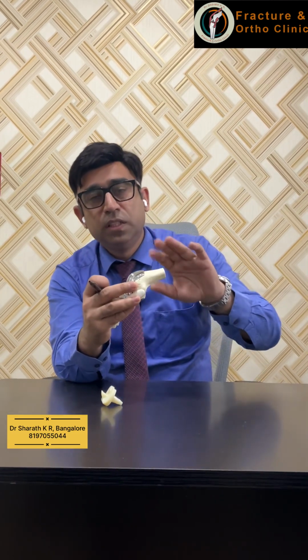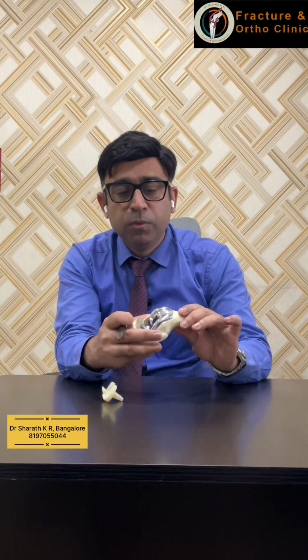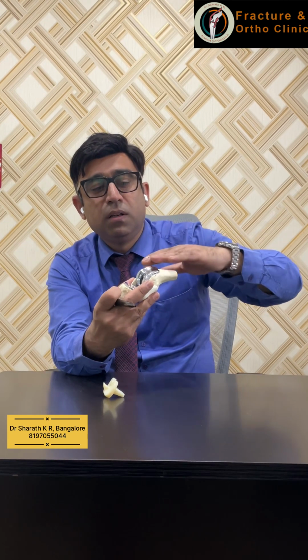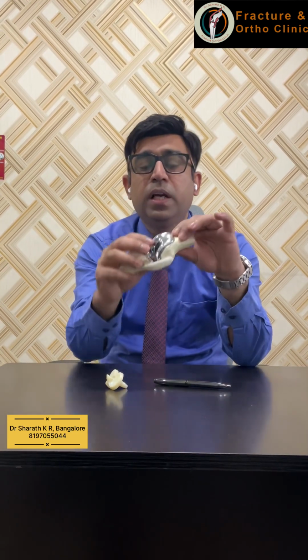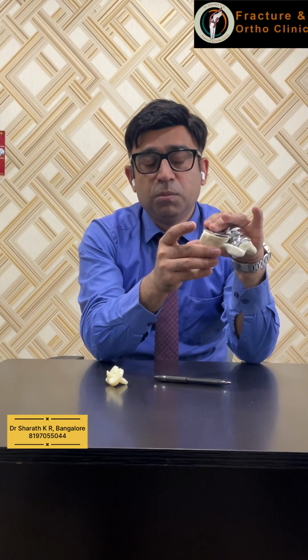You might know that this bone is called the femur. There is an anterior bowing, that means the front bowing. To accommodate the front bowing, we can increase the sagittal plane positioning of this implant along with the coronal plane tilting or proximalization or distalization of this implant. To summarize, we can increase the sagittal plane flexion, we can increase the rotation of this component, we can increase the thickness of this distal femur, all these values up to 1 mm or 1 degree during the surgery. Likewise, we can do the same thing in the tibial component.